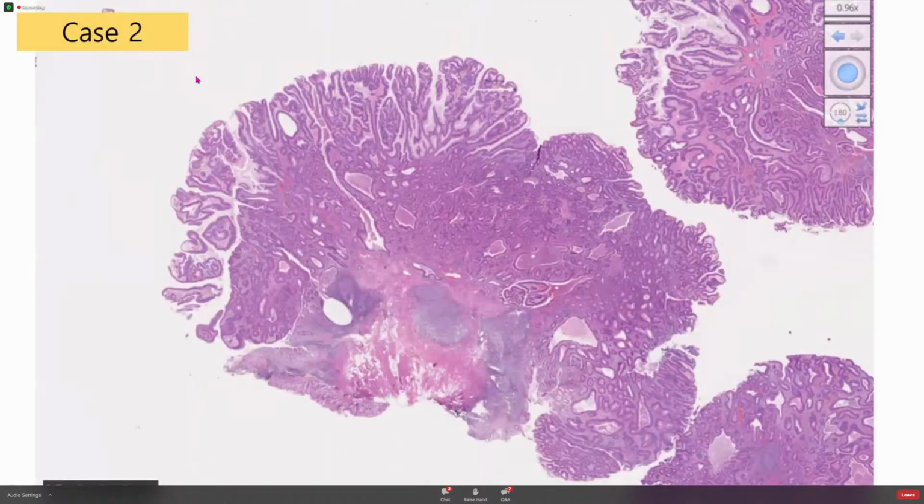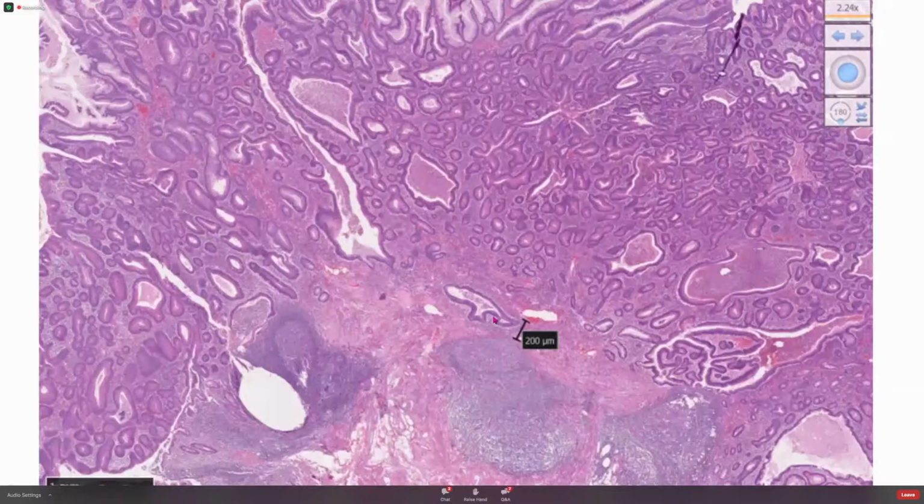And the second case reveals this focus is normal epithelium. This one is low grade adenoma. This focus reveals more complexity, so it is high grade adenoma, and it also shows angulated glands beneath the muscularis mucosa. So these cells reveal an invasive focus beneath the muscularis mucosa, so this one is adenocarcinoma in the submucosa. Do you have any questions?